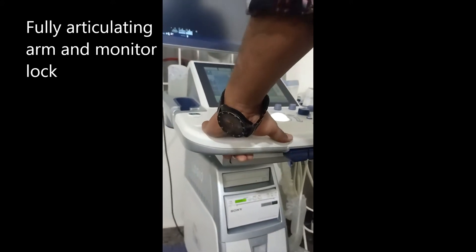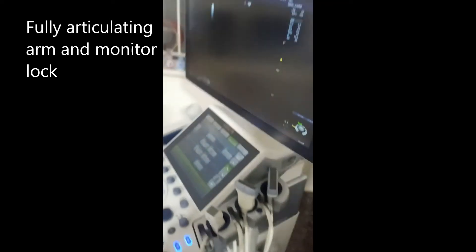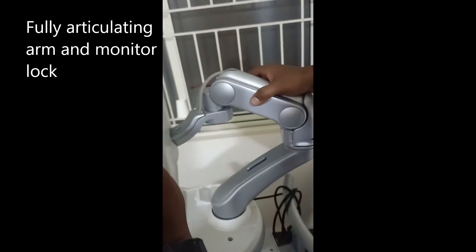This is a very user-friendly machine. Here you can see the monitor — you can adjust it.